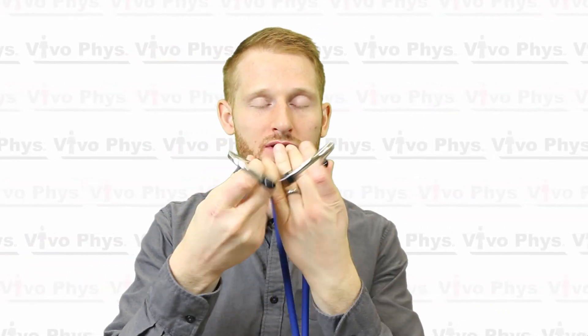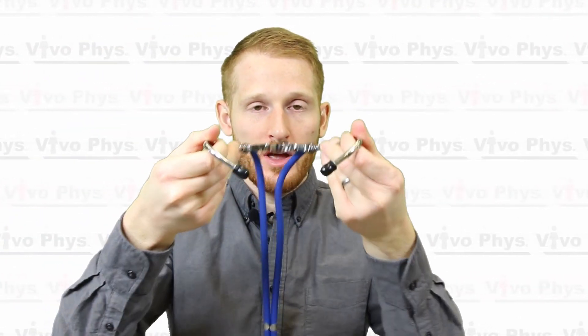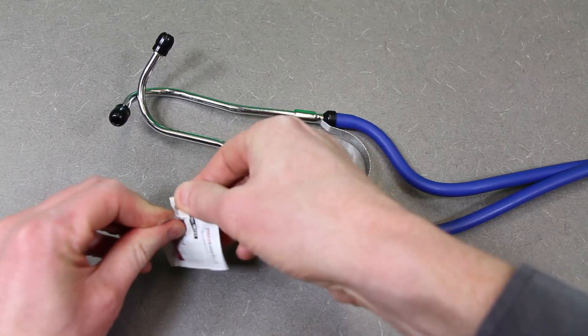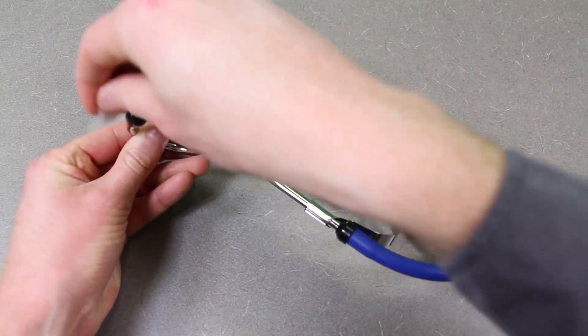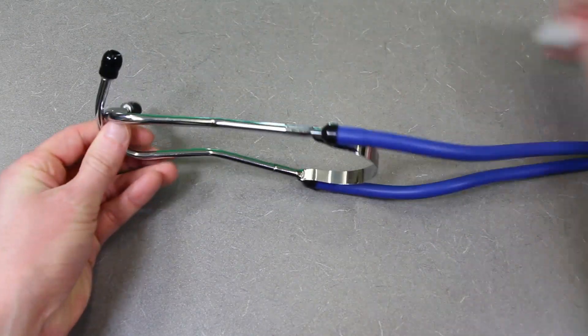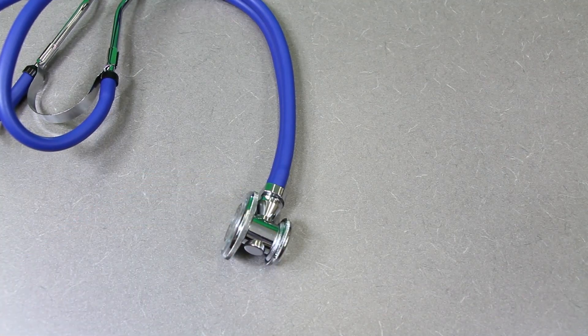Grab your stethoscope, which is what you'll use to listen to the blood pressure, and check the angle of the earpieces — they should point downward so that when placed in your ears they angle toward your nose. If you're using a stethoscope that someone else has used recently, make sure you clean the earpieces thoroughly with an alcohol swab. It's also a good idea to occasionally clean the diaphragm and the bell.